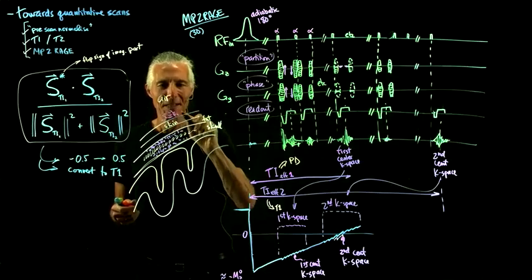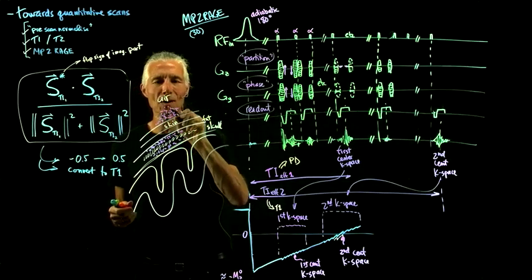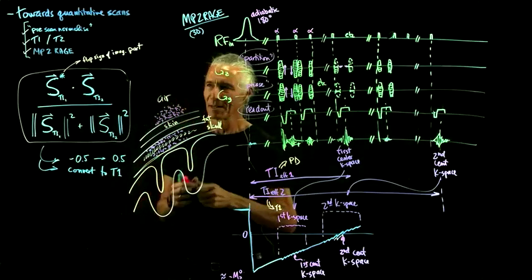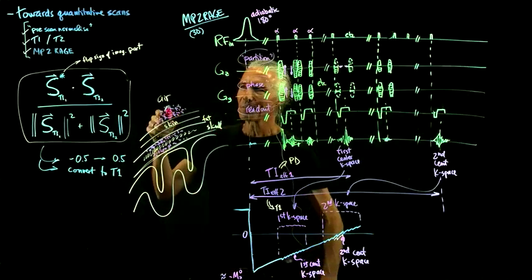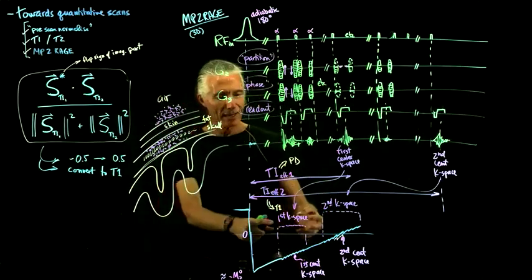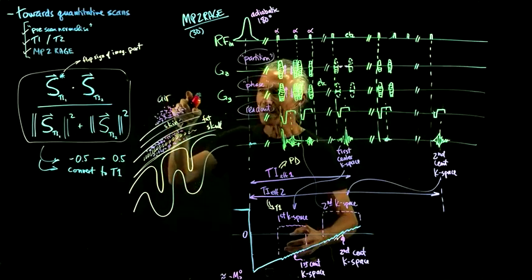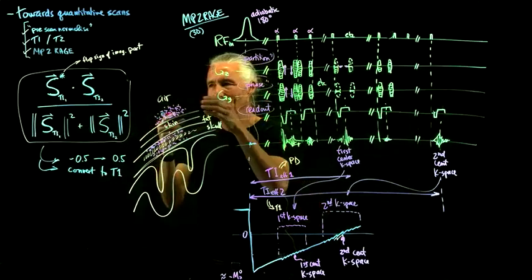So if you take an image like this, even though it's much better and much more quantitative, and just feed it into a program that's designed to segment the brain, it's not going to work because there's a bunch of junk in the skull and a bunch of junk out in the air. You could fix that. You could take the proton density weighted image, which does have black out in the air, and use it to mask out all that junk.